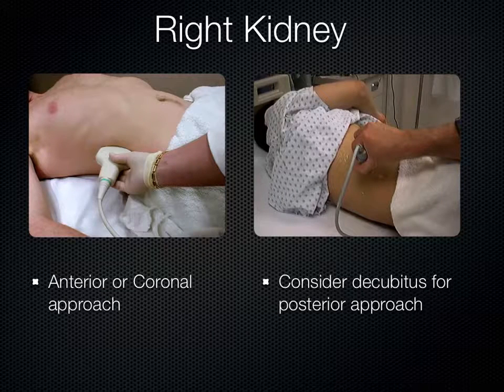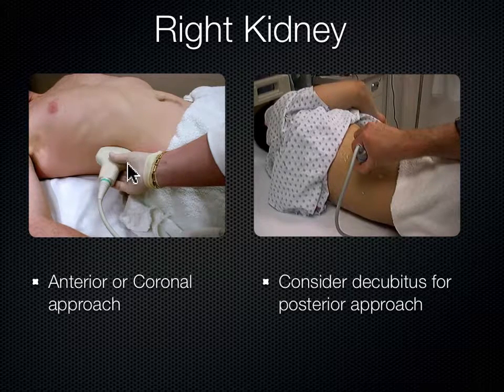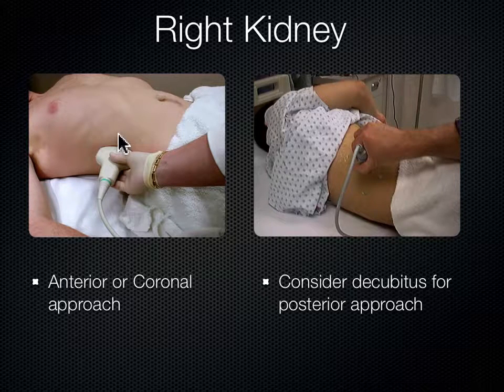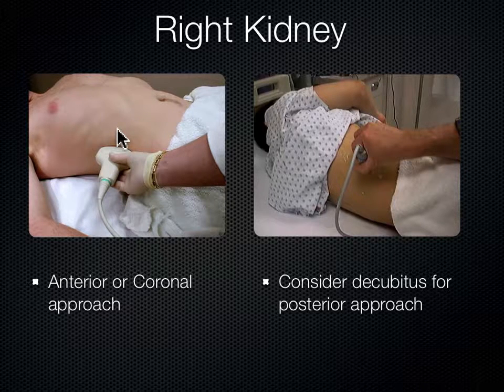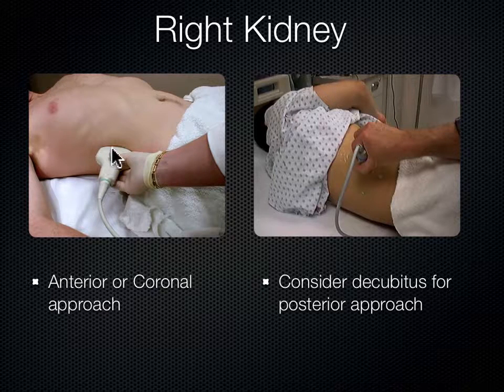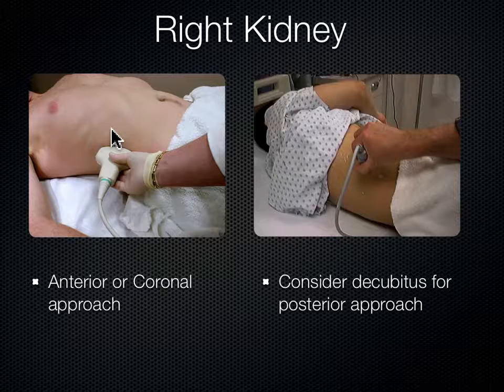On the right kidney, there are really a couple of ways to look at it. You can come from the side of the body, which we call coronal. Sometimes you get really good views just straight off the bat. Occasionally you've got to drag the probe anteriorly, but the kidneys are still a posterior structure, so to compensate, fan the probe posteriorly. Using the liver or the spleen as your window to see into the kidney is actually often a better approach than even a coronal view. Every patient's different—this is the art of sonography.